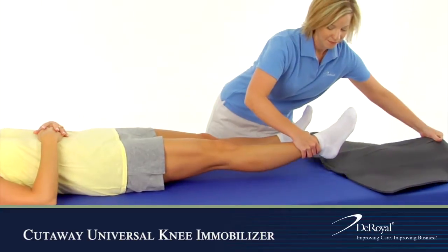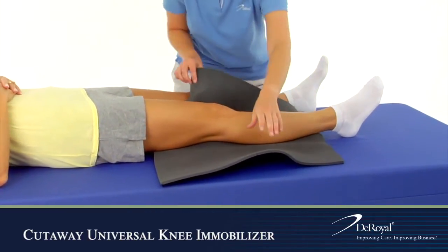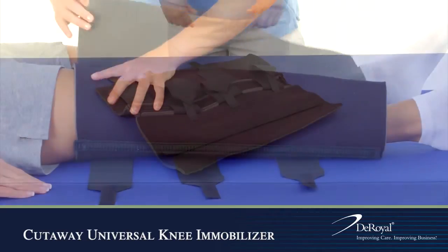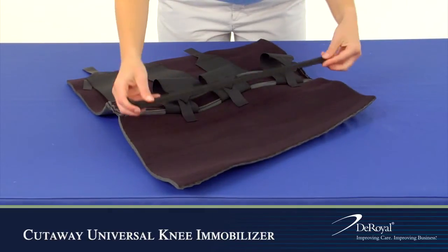Wrap the immobilizer around the patient's leg, aligning the center stay with the back of the leg. The side stays should run parallel. Move the stays to adjust the fit and trim any excess material.